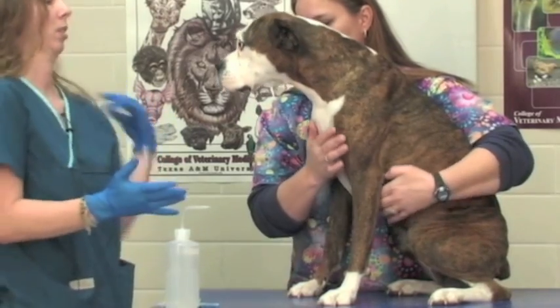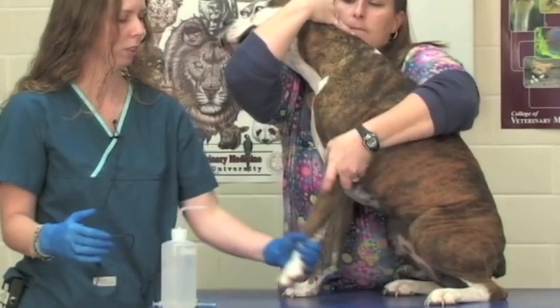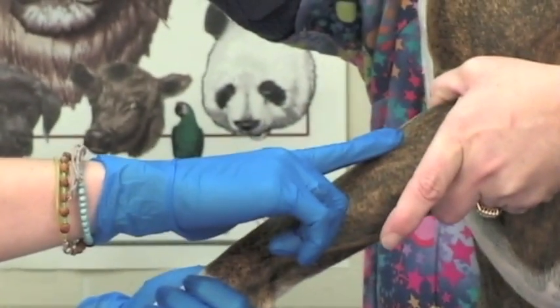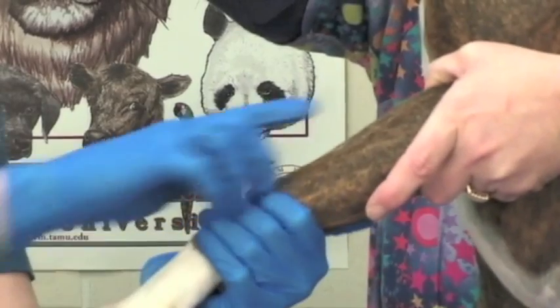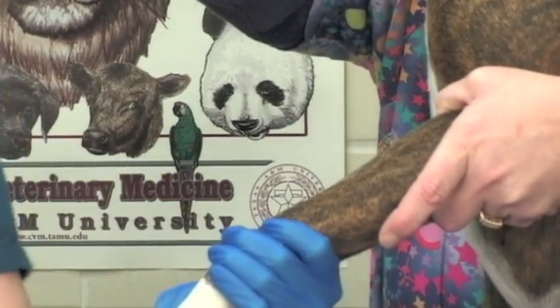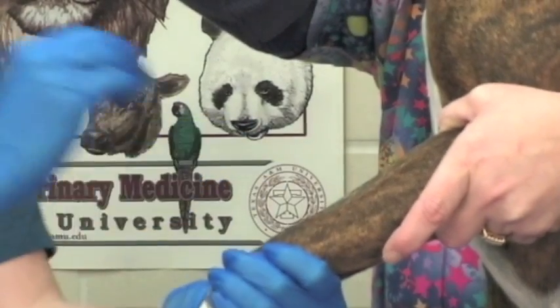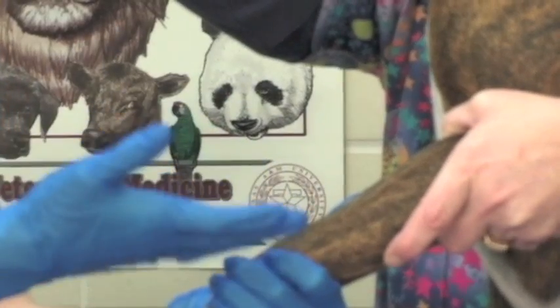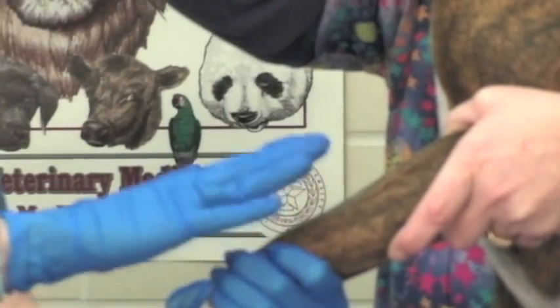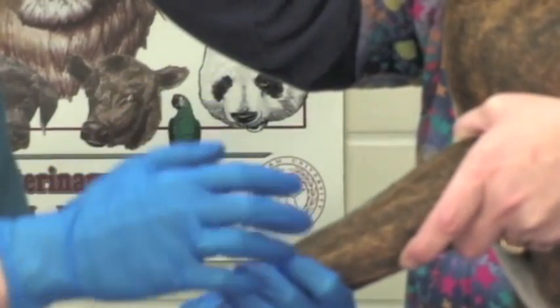As soon as I have my gloves on, my restrainer will do what we call rolling off the vessel and she will hold a tight grip with her thumb right in the elbow. This will make the vessel on the top of her front leg pop up really nicely for us. Then we can wet down the fur — in patients that do have long hair this alcohol will help wet down the skin and lay the fur closer to the skin so that it's easier to visualize and palpate the vessel.